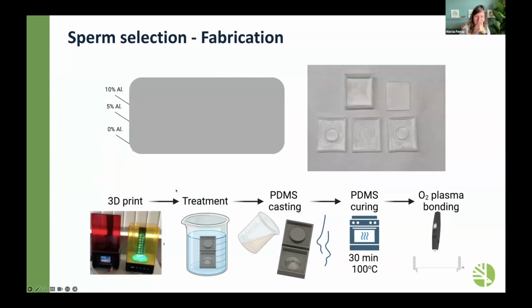So again, we prepared it with 3D printed modules. One thing that we had to do, and I can disclose this, is that the PDMS is not really good at dissipating the temperature homogeneously. So one thing that came to mind was to introduce aluminum hydroxide in the PDMS, so it would help spread the temperature. And that's what we did. We started with different percentages of aluminum in there, which also helped us create this gradient that we were looking for.